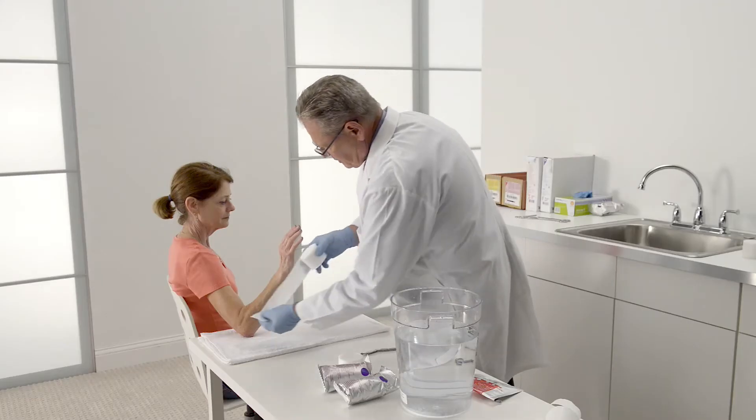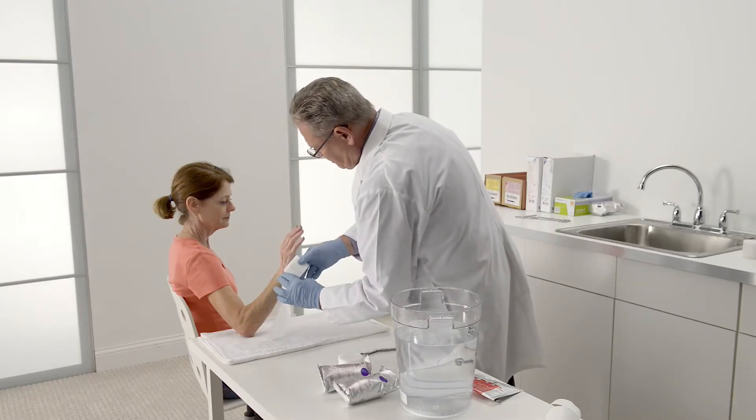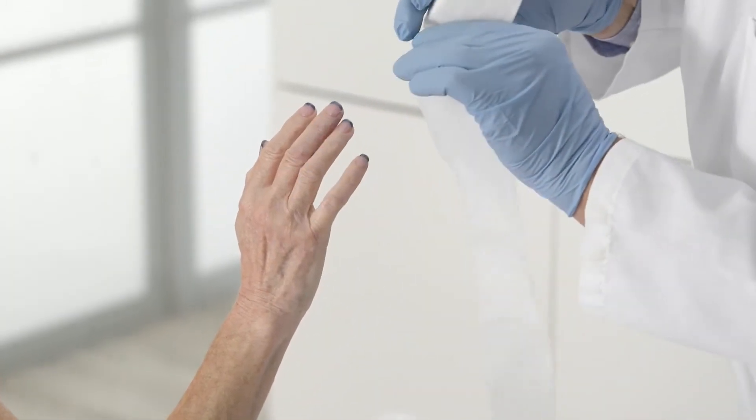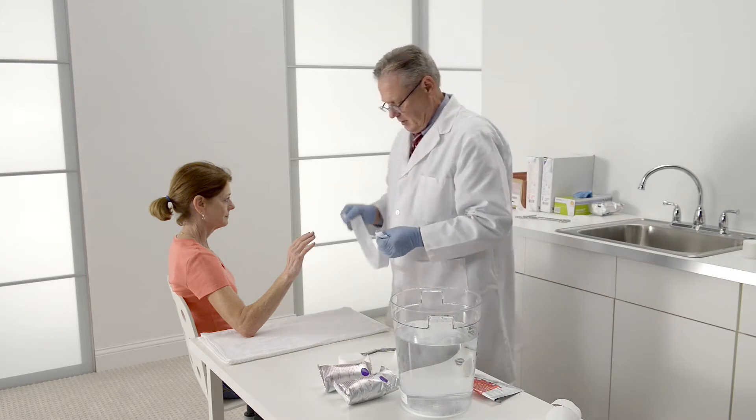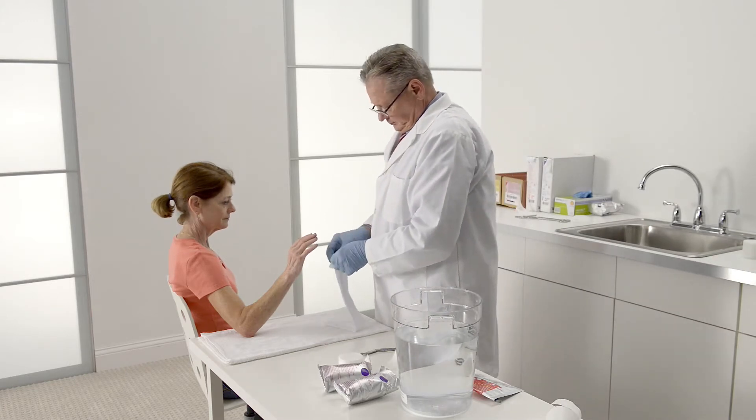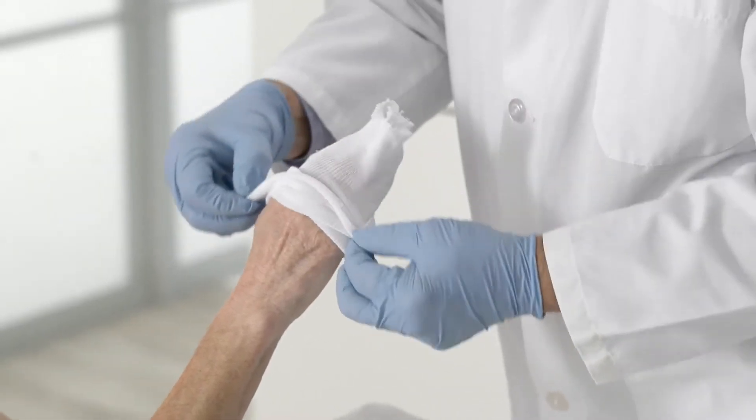First, cut the 3M synthetic cast stockinette long enough to extend from the patient's fingertips to just above the elbow, plus one-third of that total length. Remember, the stockinette becomes shorter as it widens in diameter. Roll the stockinette down the arm.